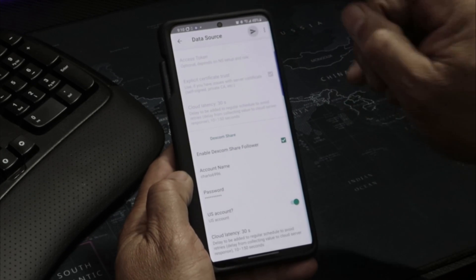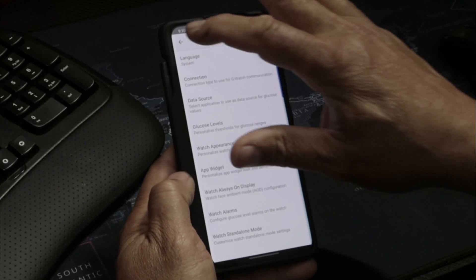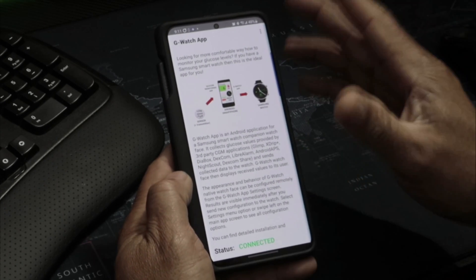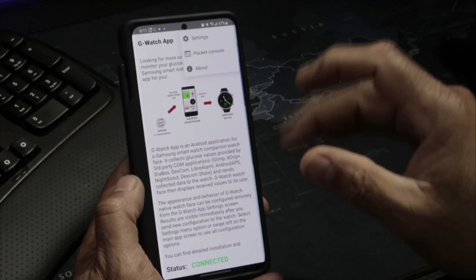Tap that button and it will set up your phone. You can see I'm connected and everything is looking good — and on my watch everything is set up and looking really good too.